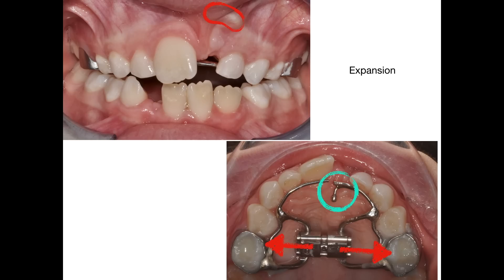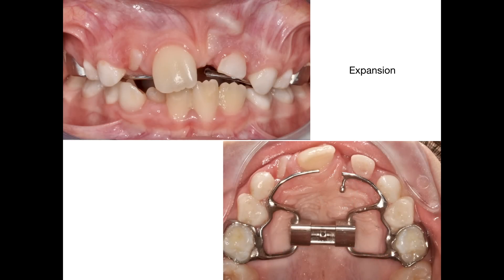The expander is equipped with a hook just below 21 which will help us not to lose dental anchorage in the first phase of traction. We can now see the profile of the incisal margin of 21 well enough to make a small incision, remove some mucosa and bond a button on it.